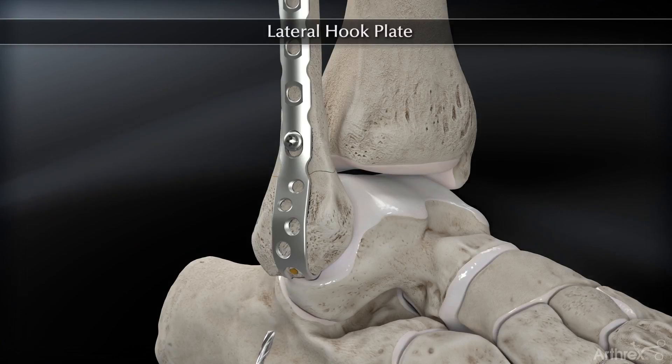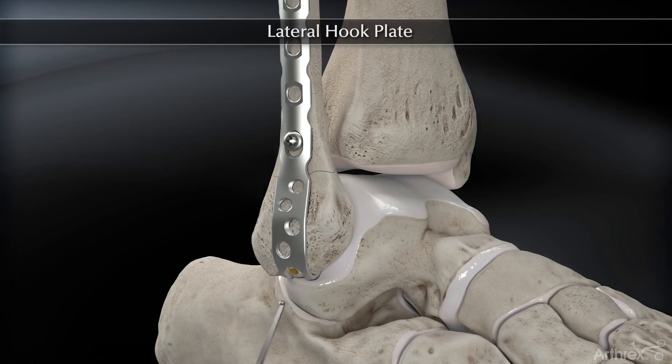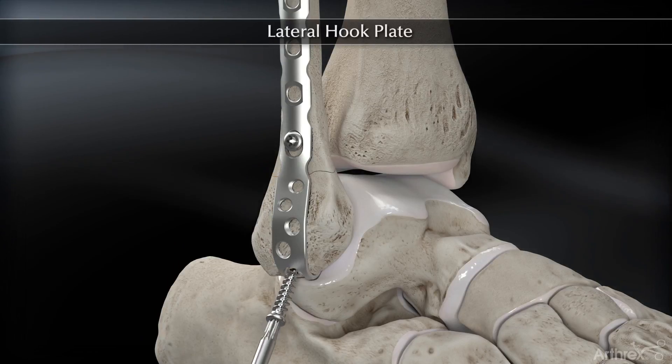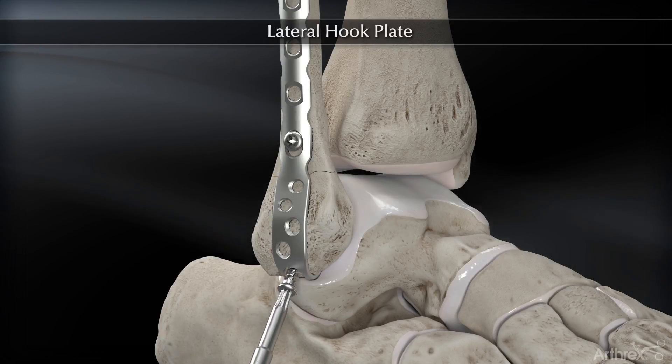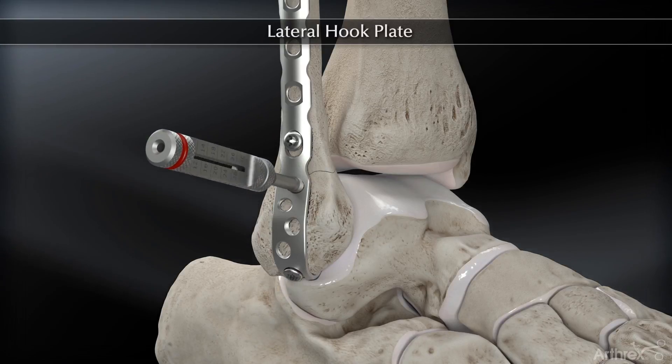At this stage, a 4.0 millimeter cancellous screw is going to be inserted distally, further compressing the tines and reducing the fracture. One may have to loosen the initially placed screw to allow for further compression.